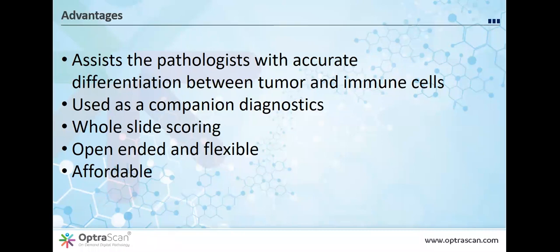But clearly, there are approval processes in other countries, and I'm not trying to demean or diminish the CE mark in Europe and the Canadian process. They're all very good. It's just that the FDA sort of turns out to be the elephant in the room, as it were. It's complicated because what happened when the IHC test for PD-L1 was developed is that we saw brown staining on the surface of cells.